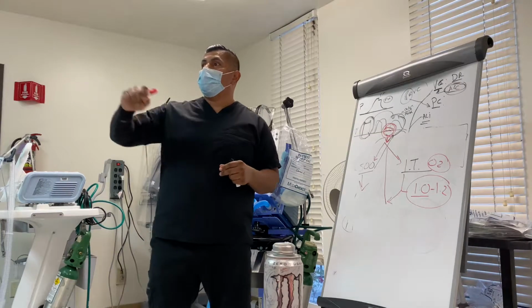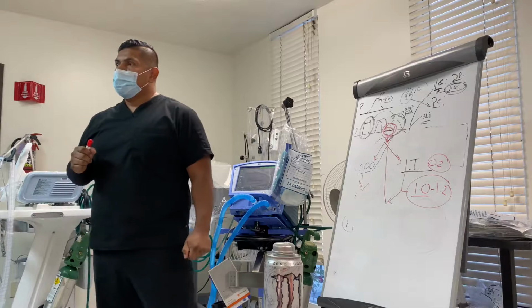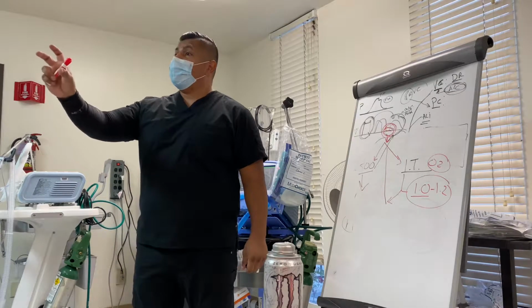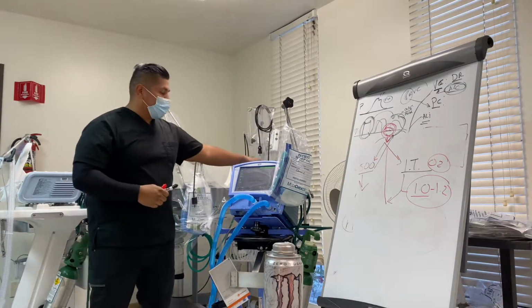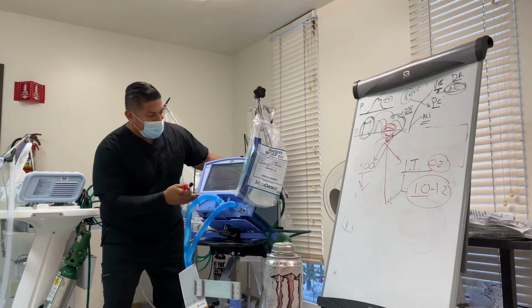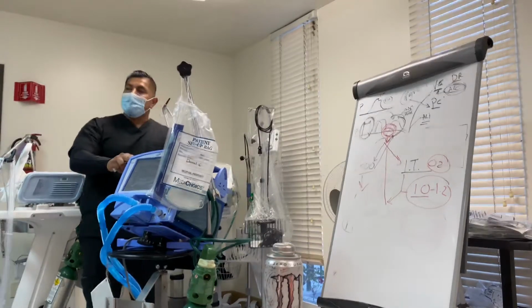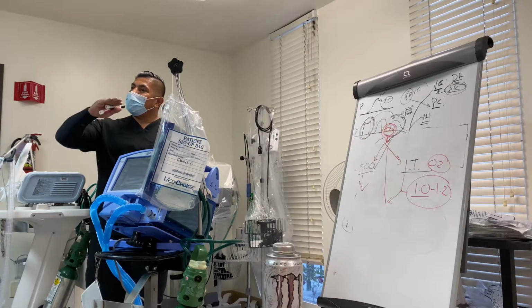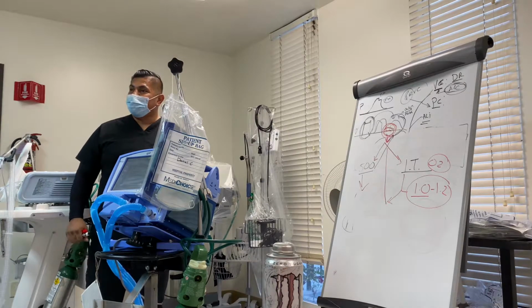Yes, ma'am. So the I time and the inspiratory hold are basically the same? You adjust your I time to achieve an inspiratory hold. To achieve the hold. Yes. Okay. So I have a little vent right here. If you take a look at the second scalar, notice how my I time is a little bit greater than 1, but notice that inspiratory hold at the end. That's what we're aiming for.